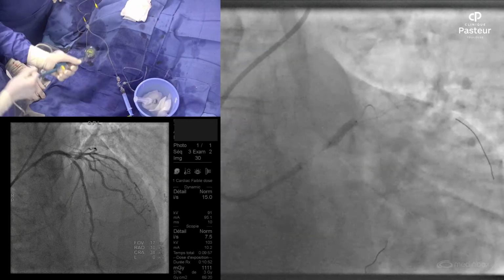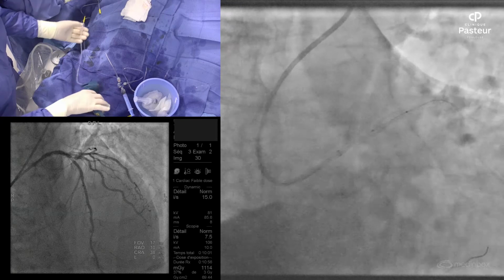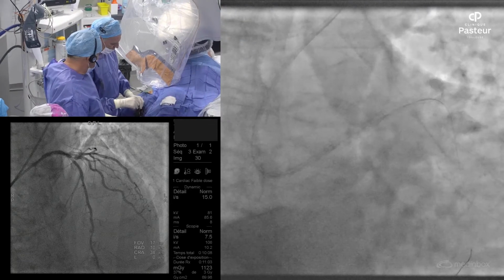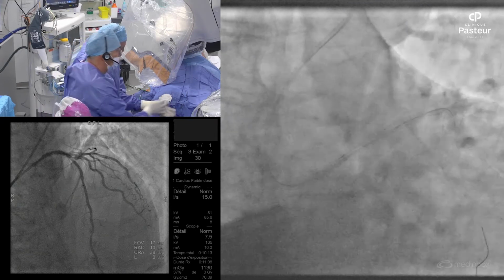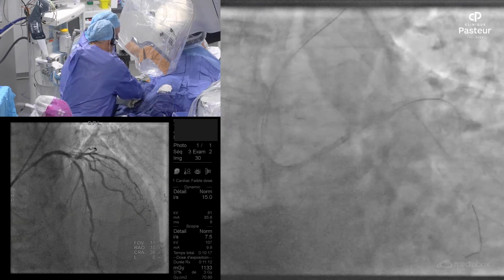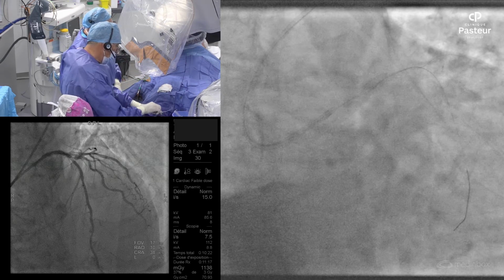stent. And what we will do systematically, without the use of intravascular imaging, is to take a 3.5 short balloon in order to do the post-dilatation. Because we are treating a bifurcation, and the diagonal is a quite large branch, at least 2.5, even 3.0. So normally the diameter proximal to the bifurcation, normally it's at least 3.5. We can take a view, and I think that we select a 10 millimeter.